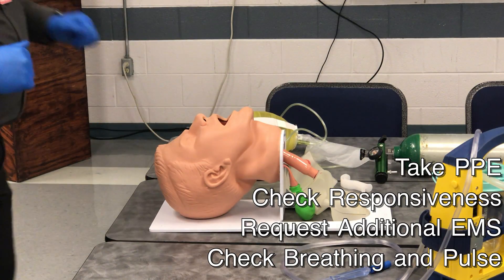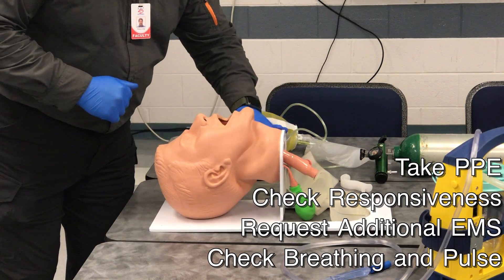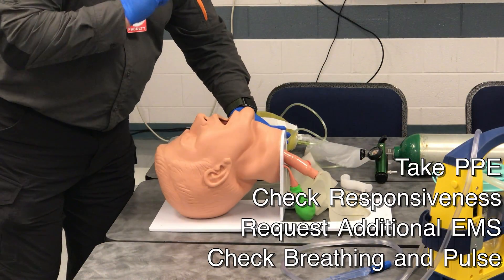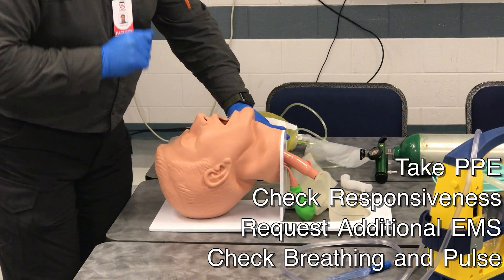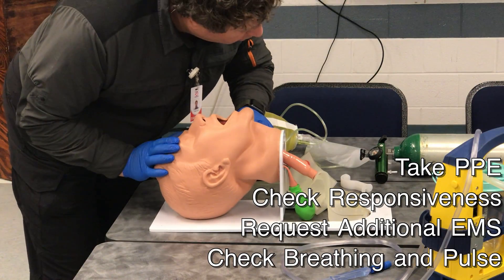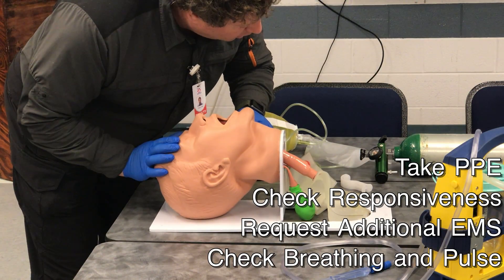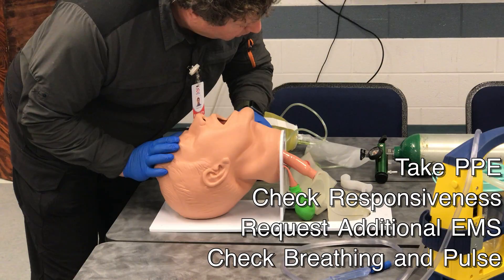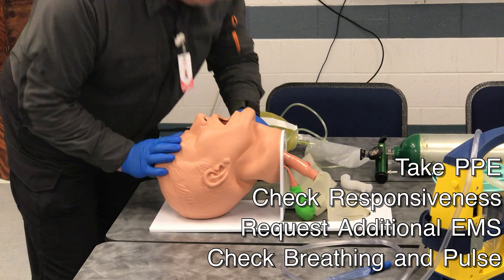Approach the patient. Hey, hey, are you okay? He's unresponsive. I'm going to send my partner to get assistance to get the airway back. I'm now going to check for a pulse and check breathing. He is not breathing, but has a pulse of approximately 60.